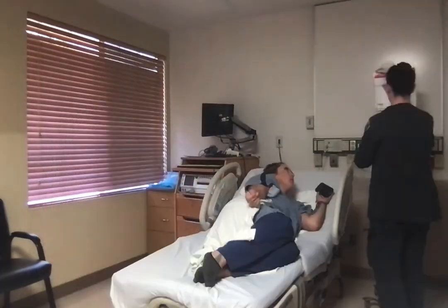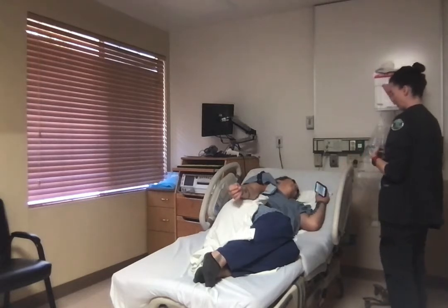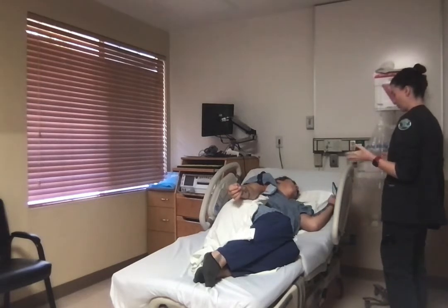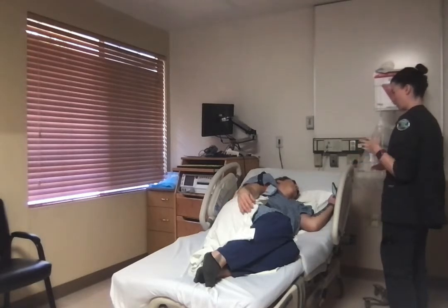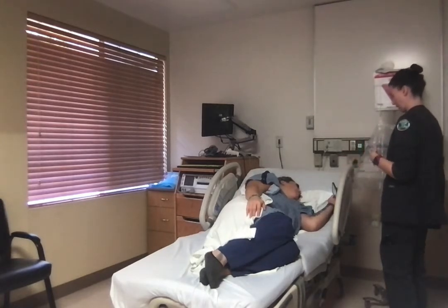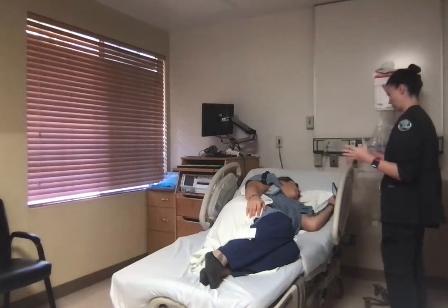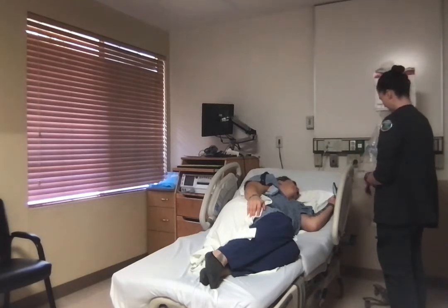His heart rate is doing better, but like I said, with the epidural, it can be common for your blood pressure to drop, and that also can make his heart rate drop. We try and compensate for this before we even start the epidural. We give you fluids beforehand, but everybody's different. Some people need extra fluids, so these extra fluids should help get your blood pressure back to normal, and that should help get baby's heart rate back to his normal. Okay, that makes sense.